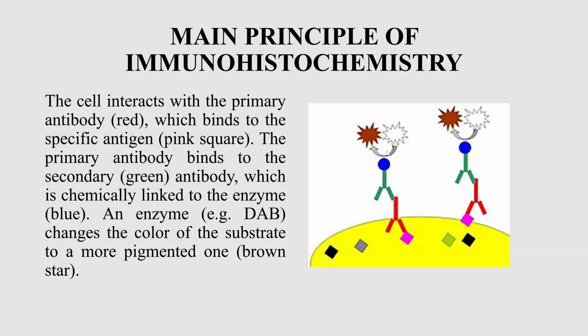So we have invisible diaminobenzidine, which in the visualization reaction changes structure and becomes brownish.